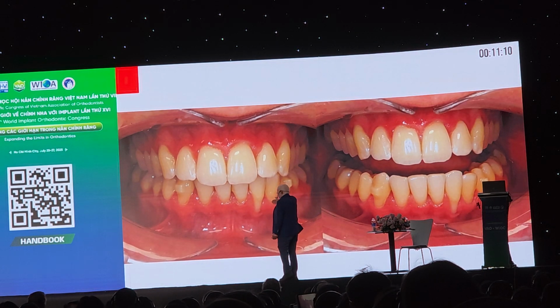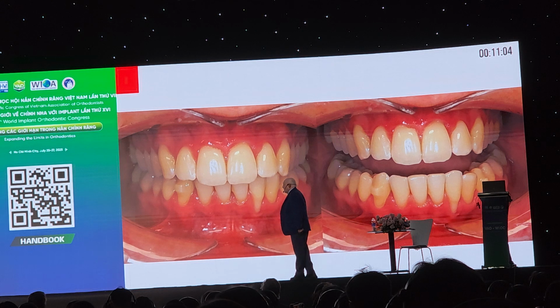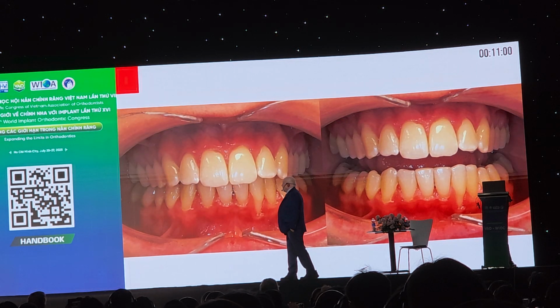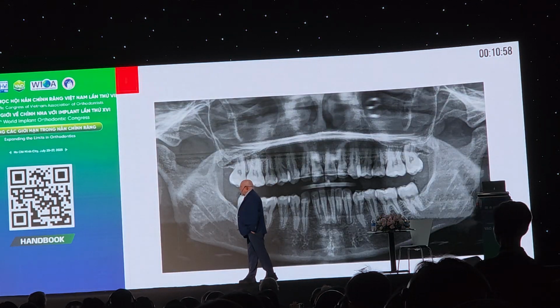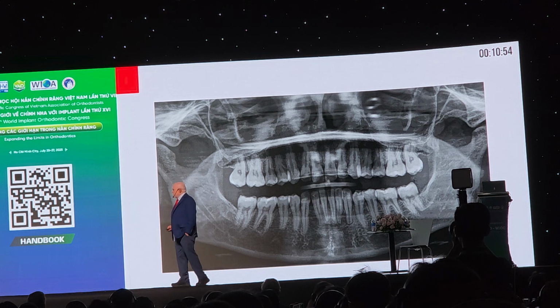Take a look at here. Lateral incisor. You've got to move the lateral incisor, we've got 2 different directions. So, there we are in our patient. And you can see that we did this, I think, in 24 aligners.